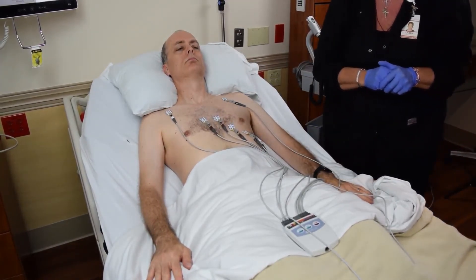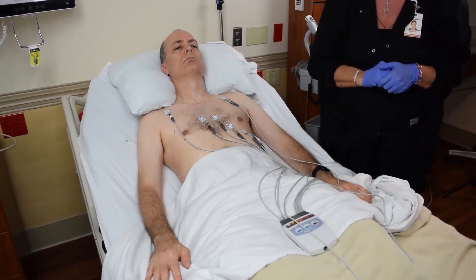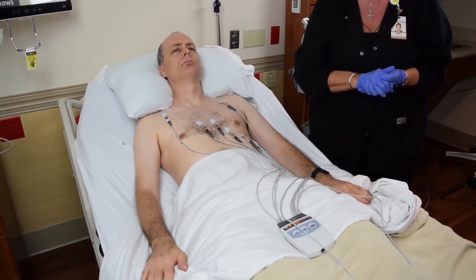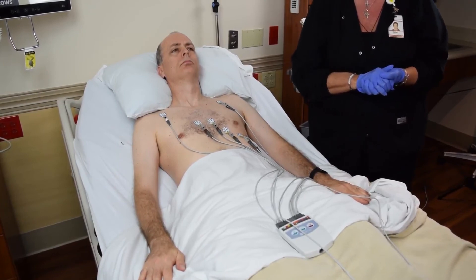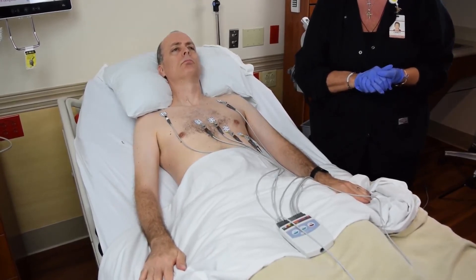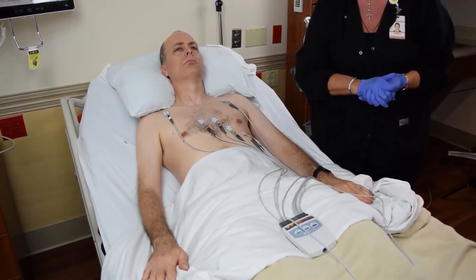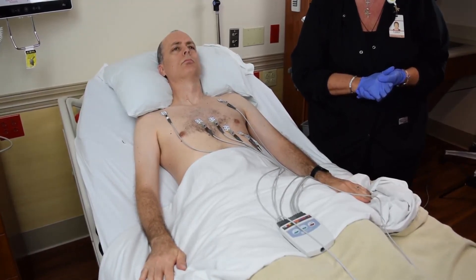We hope that this helps with placing leads when doing an EKG. It is also important to note that if the patient is connected to an external monitor, as found in CCU, the leads and patches do not come in contact with the existing monitor leads and patches that the patient is connected to. This will cause interference on the EKG and give you a false reading.